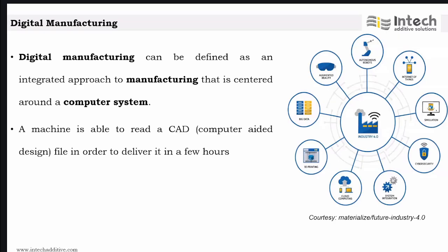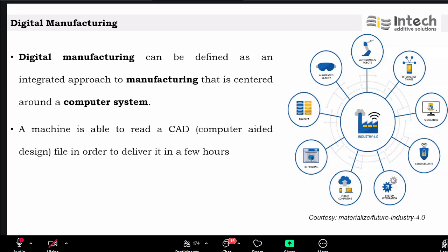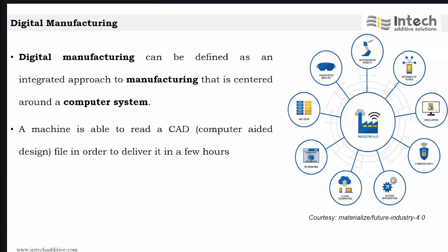And then we have augmented reality. It's about visualizing the part before printing, and it helps to collaborate across different teams virtually. And then we have cybersecurity, which is to protect the design files, prevent unauthorized manufacturing, and secure supply chains and so on. And the last is automated quality, where sensors verify dimensions, and can be used for verifying material properties and surface finishes. It can be completely automated.